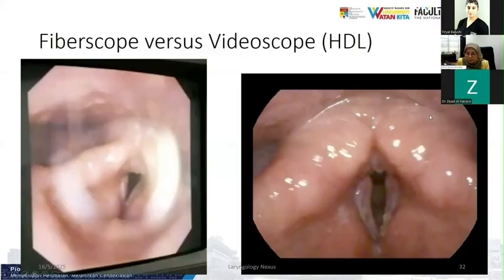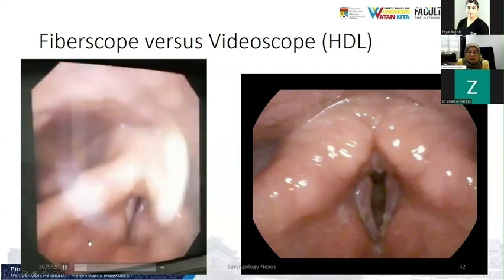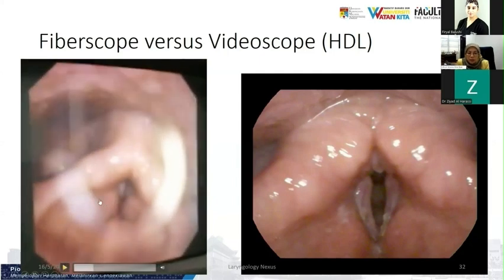I have a case, a patient who was referred to me because the patient is a chronic smoker but unsatisfied with the diagnosis of laryngopharyngeal reflux given by another doctor because of this finding. This examination was done elsewhere using not a video endoscope.